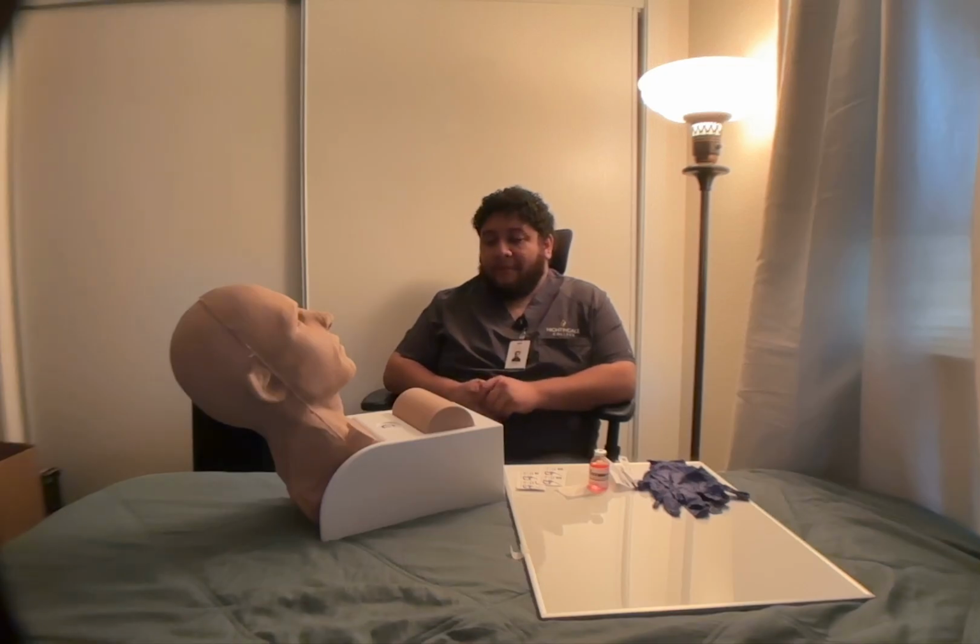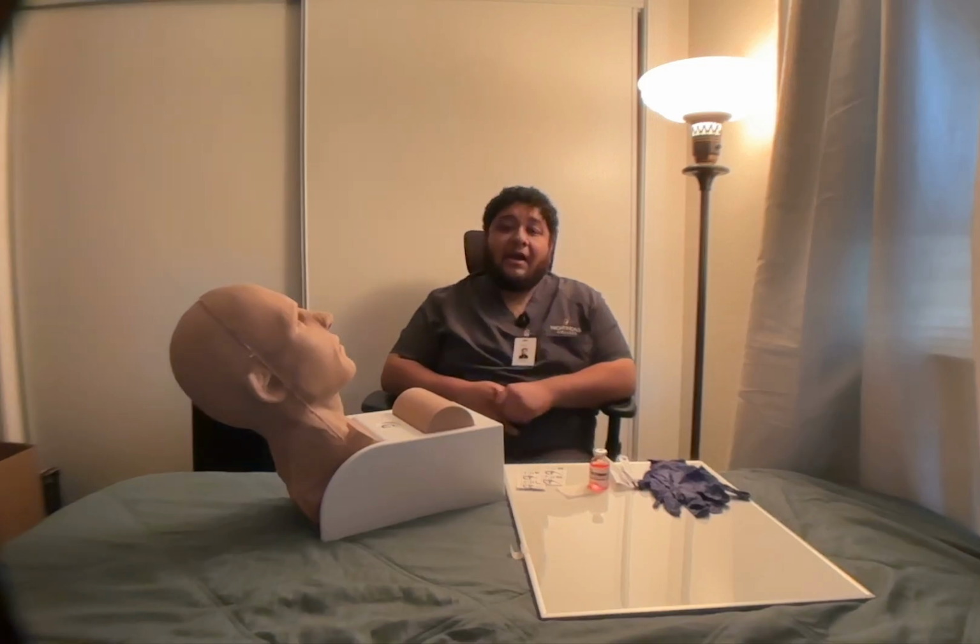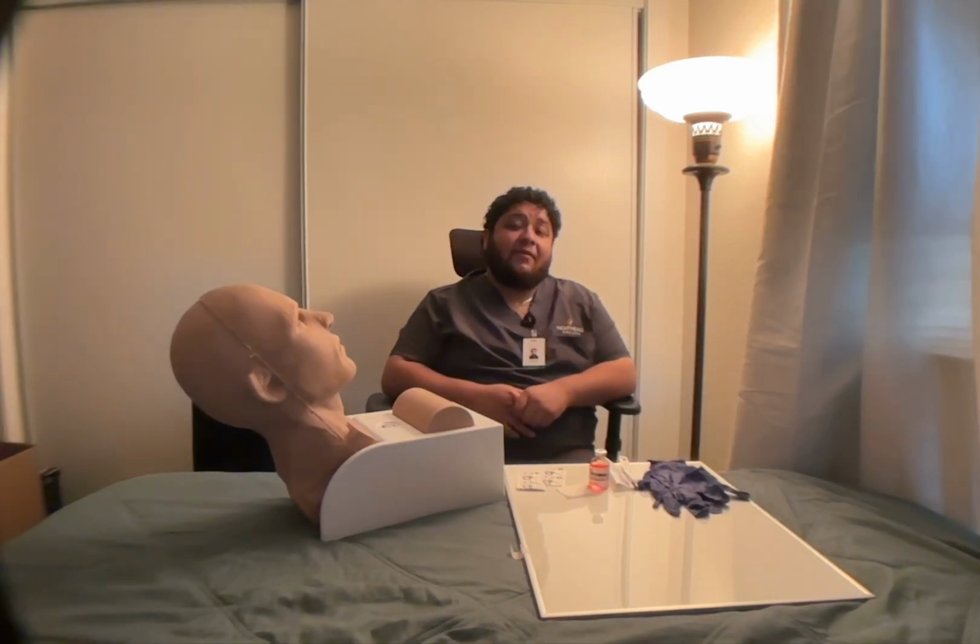You might feel a slight burning or stinging sensation during injection. It's normal, so don't worry too much about that. Now I'm gonna allow the patient to ask any questions. Mr. John, do you have any other questions for me? No questions. I will prepare the medication and I will verify it for the 3rd time.